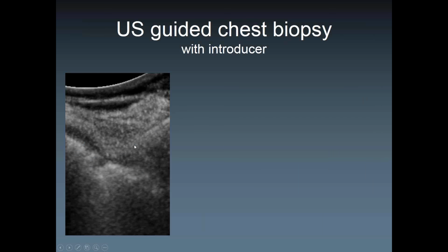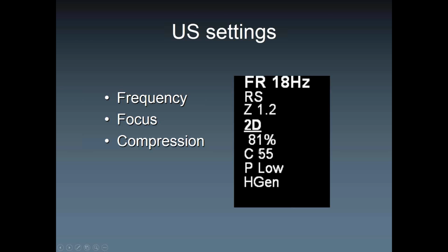The higher this number, the more grayscale values you're going to have in there, which means the more milky the image is going to be. If you bring the compression down, which means like a narrow window, you're going to have a more crispy image, but it's also going to be more noisy. That's important to know. You have to try to identify a flimsy needle within a noisy image, okay, just so you know that. And frequency and focus, of course, you all know that already.